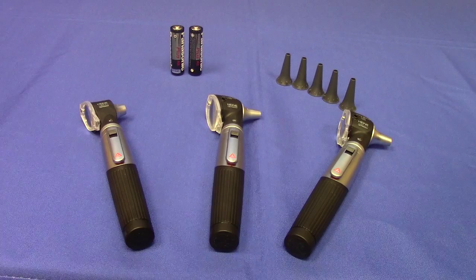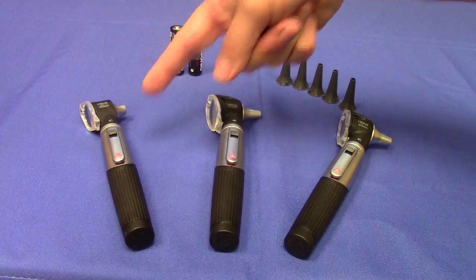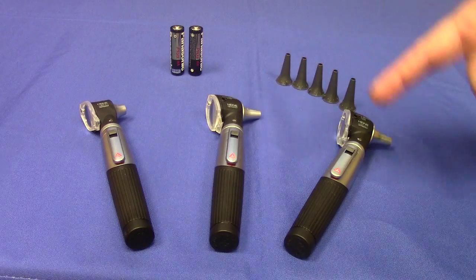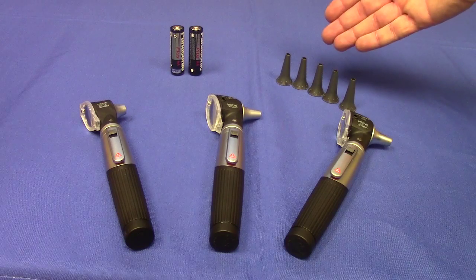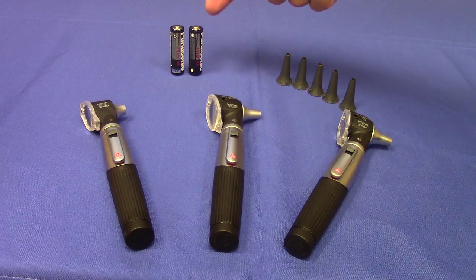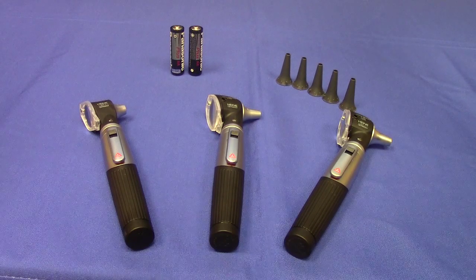The Mini 3000 Pocket Otoscope is available in three different models: the non-fiber optic, fiber optic, and the LED fiber optic. All three provide three times magnification, come packaged with at least five disposable specula, run on two AA batteries, and come in any color you want — as long as it's black.